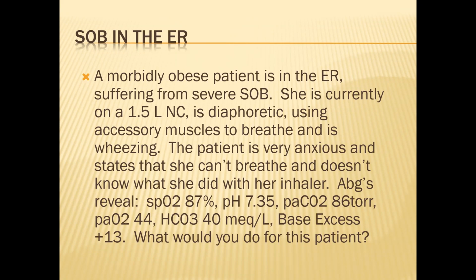Yeah, does CPAP help with work of breathing though? Wouldn't the BiPAP be a little better? You get that pressure support during inspiration, or the IPAP during inspiration. No, you only get that pressure during it, like as you're exhaling, you're keeping a positive pressure. Oh, you're right.